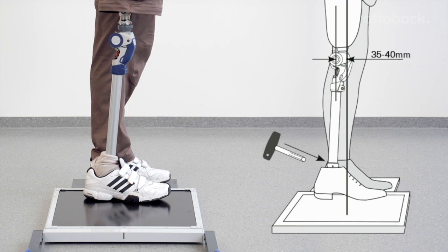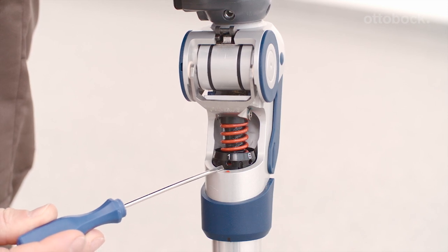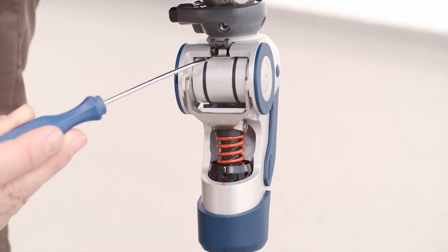Before fitting the user, please check the factory settings. The corresponding values can be found in the instructions for use. The integrated adjustable spring extension assist controls the pendulum movement of the prosthetic lower leg. The adjustment ring for the spring is set to level 1 at delivery.